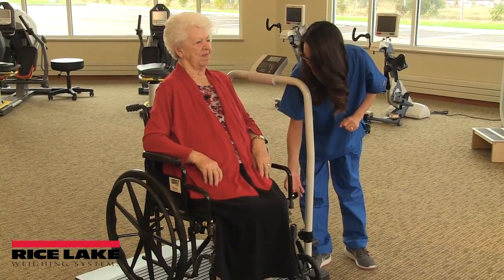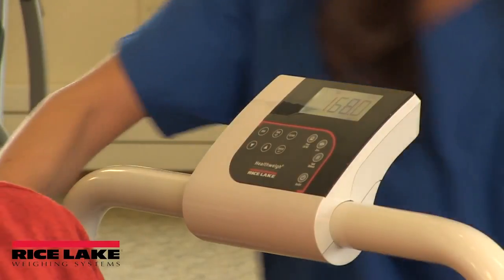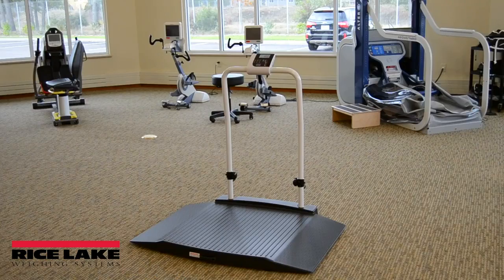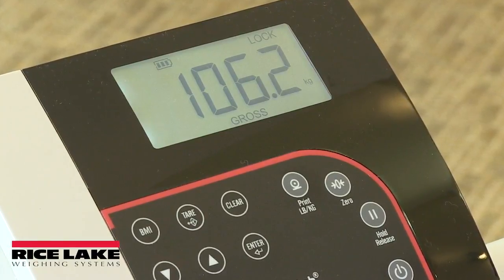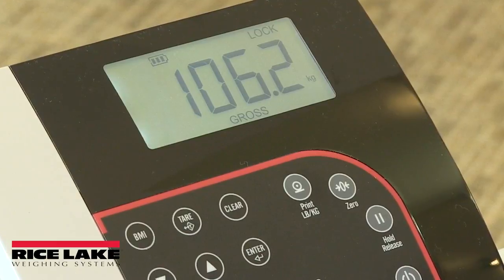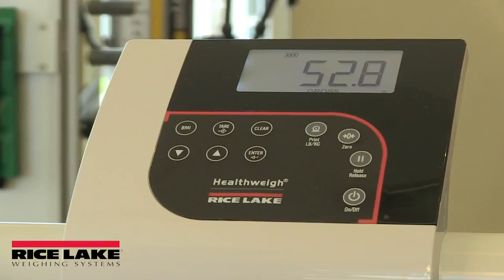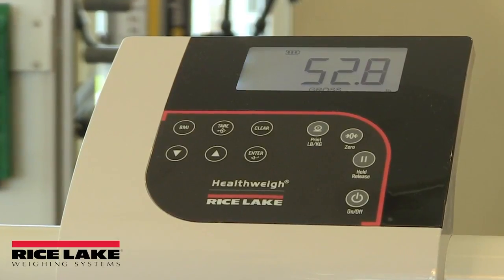Avoid touching the patient while the weight is being captured, as additional pressure on the scale will influence the weighment's accuracy. All Rice Lake Digital Medical Scales feature units of measure locking, which prevents the operator from unknowingly switching the scale between kilograms and pounds or vice versa. This essential safety feature helps prevent dosing errors due to calculations based on incorrect units of measure.